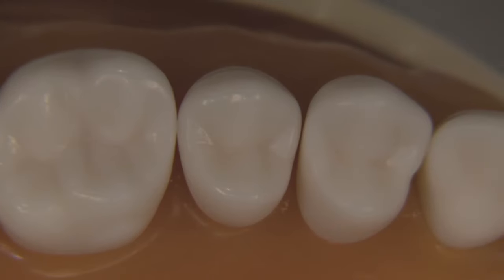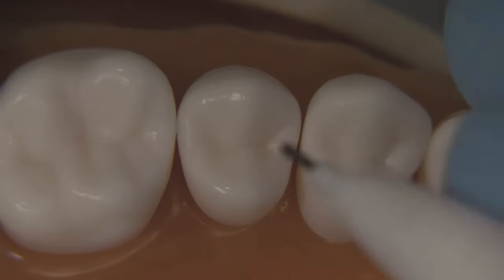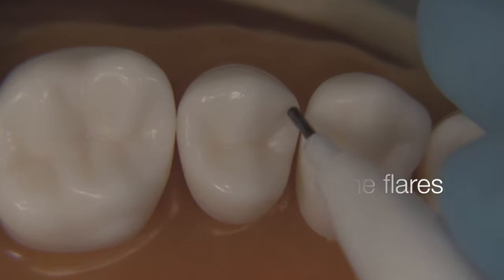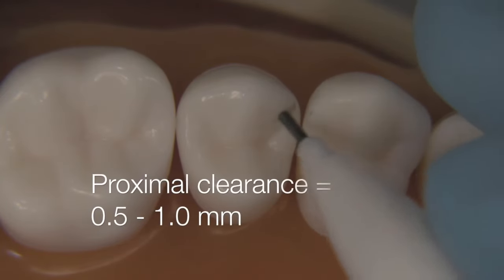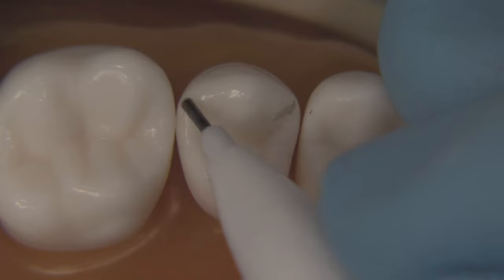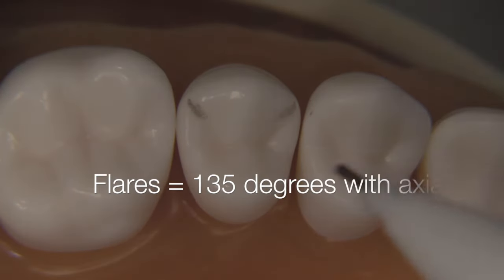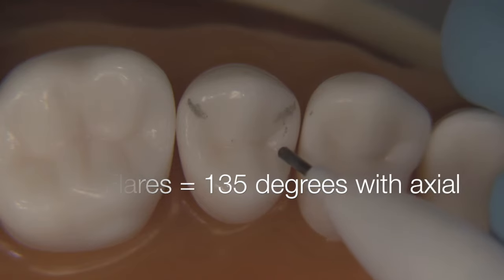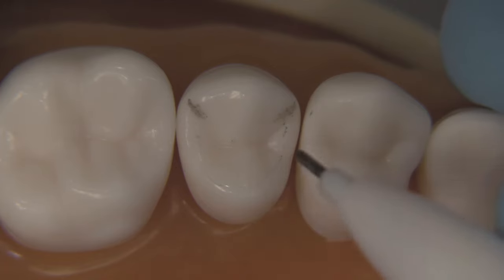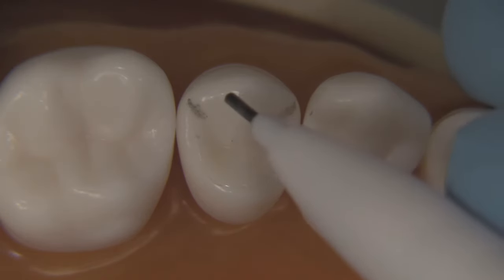What I like to do is a little bit of pre-prep planning. I'll use a mechanical pencil to show you that the flares dictate how we're going to perform the axial reduction. The flare should come out such that you have about 0.5 to 1 millimeter of clearance with the adjacent tooth, which is a little bit more than an amalgam. The flares make an angle of approximately 135 degrees with the axial wall. This should help you get an idea of the planning stages of the preparation.